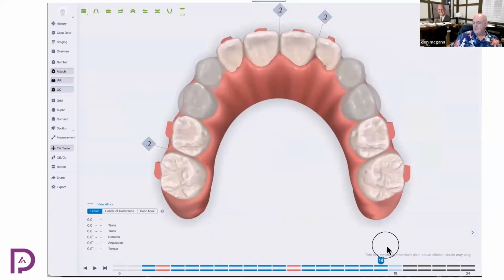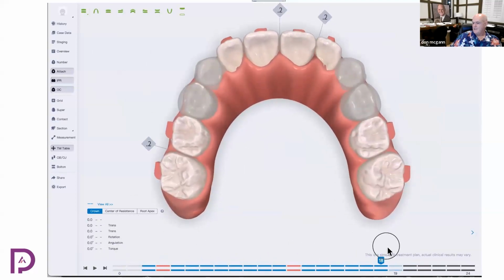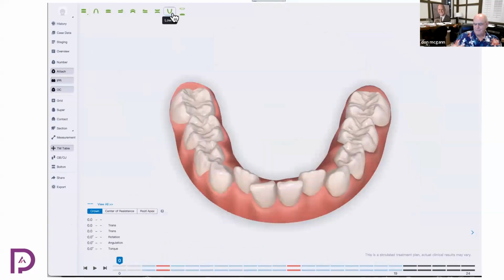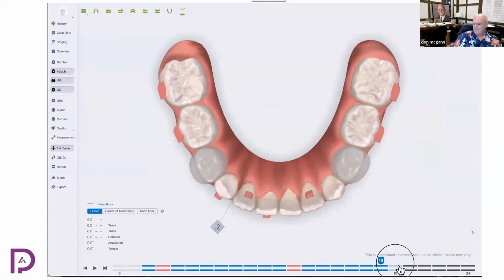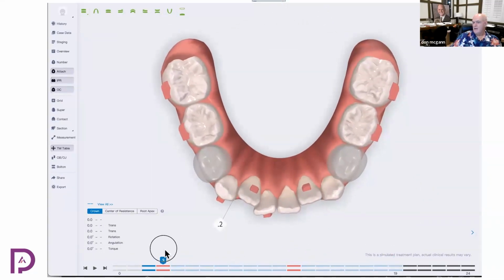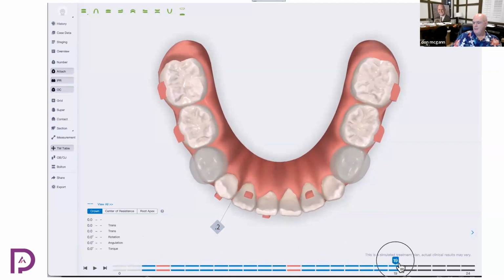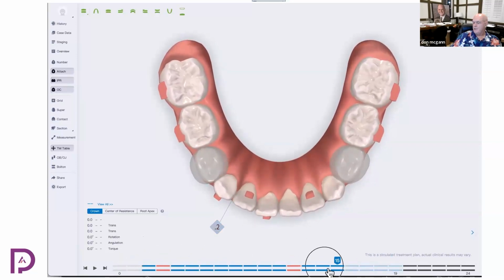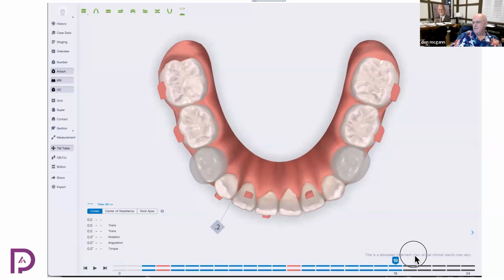Start earlier when everything is less mature. Go ahead and fix some rotations while you're at it, and then later on you can do it again, and then do it again. So in all these mixed cases, you're going to have probably a minimum of three sets of trays. Okay, this would be probably expected, maybe even 4.